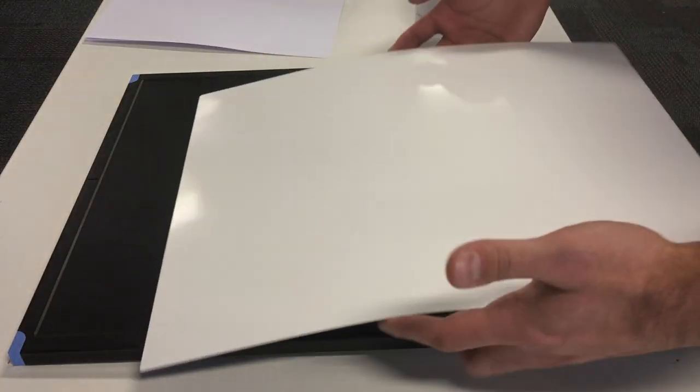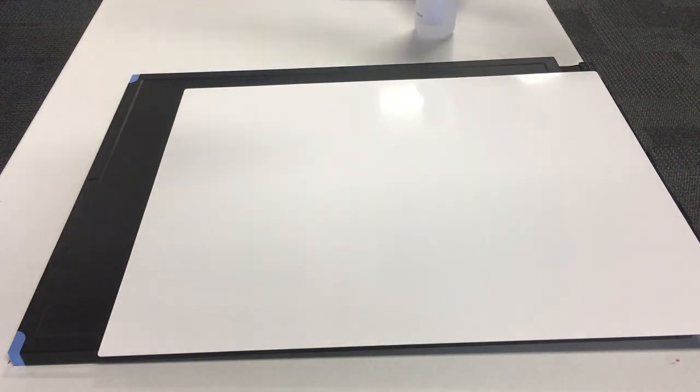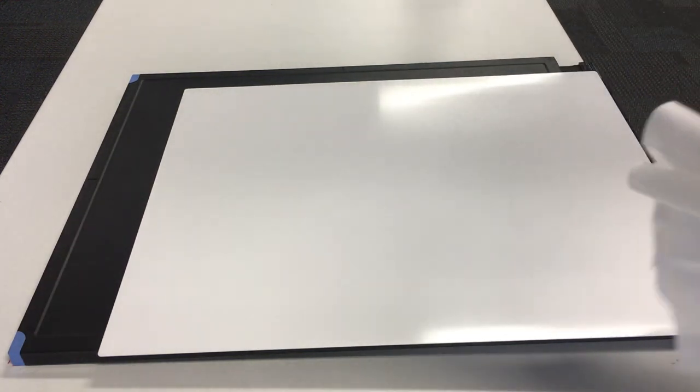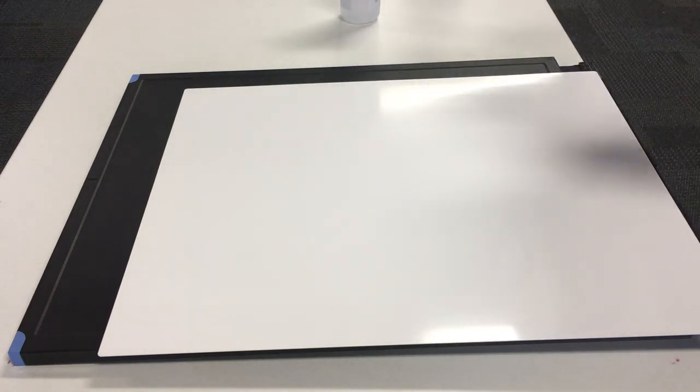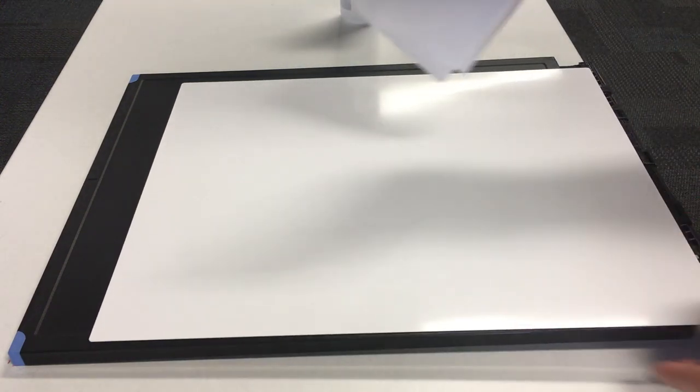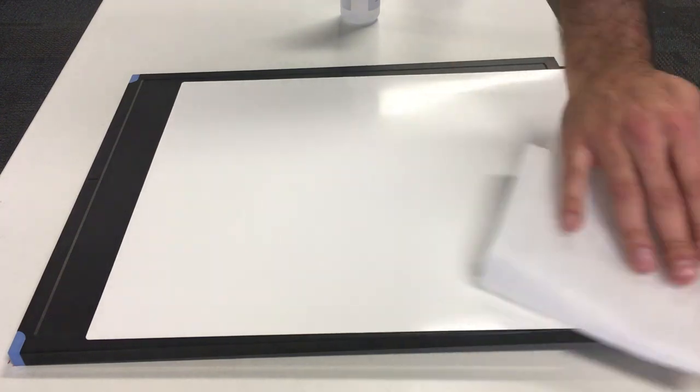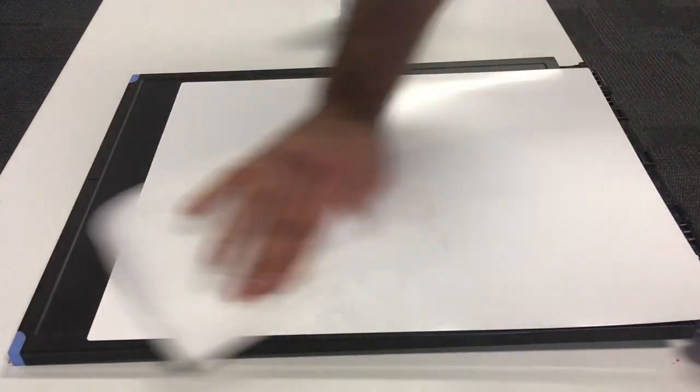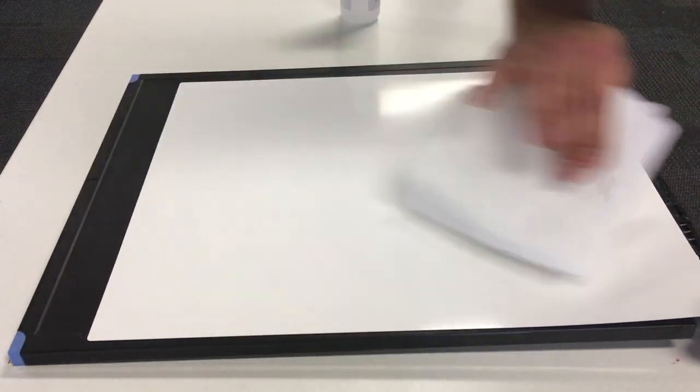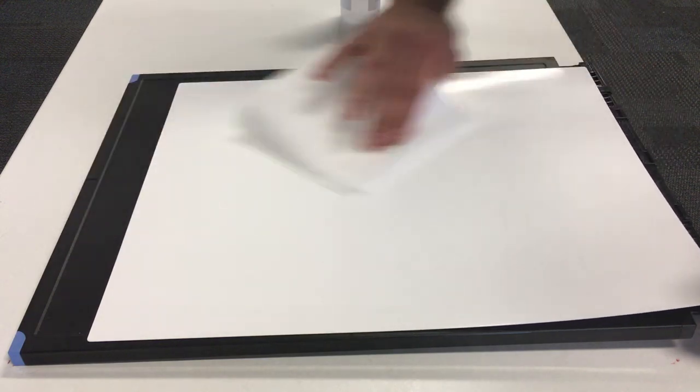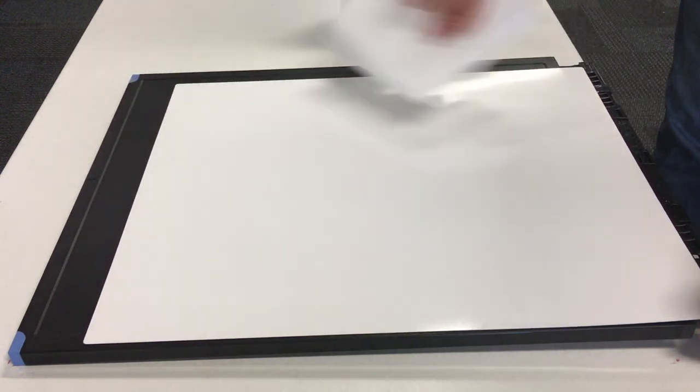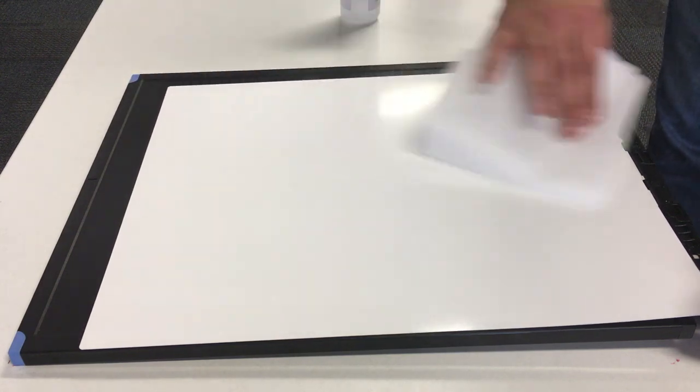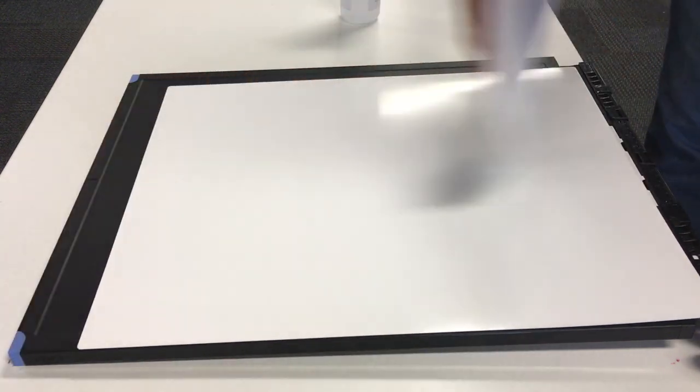And we have full access to the plate now. So we can clean this plate. I'll get my other clean lint-free cloth. And you just go very gently. Just like that. This plate is new, so it's not much to clean really on this.